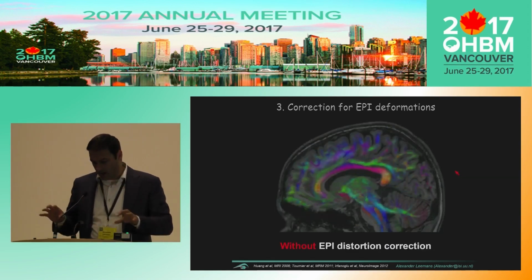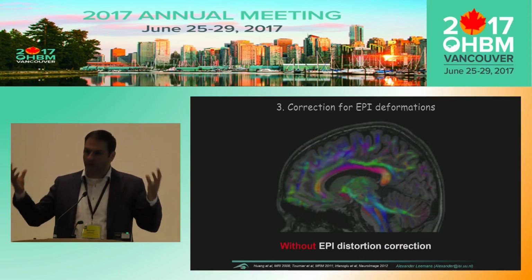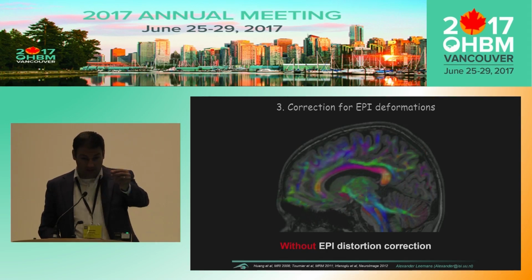Okay. And some people then say, like, okay, but what's the trick? Because if you're doing this highly nonlinear registration deformation model to warp these data, it can go all over the place, right? These optimization procedures are very sensitive to, for instance, initialization, etc. But the nice thing here is that we actually can constrain our degrees of freedom to the phase encode orientation, right? These distortions are dominant in the front to back orientation.